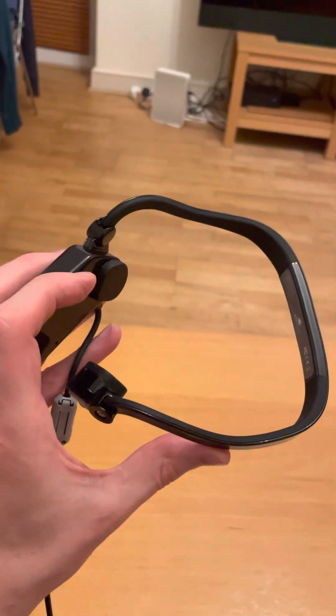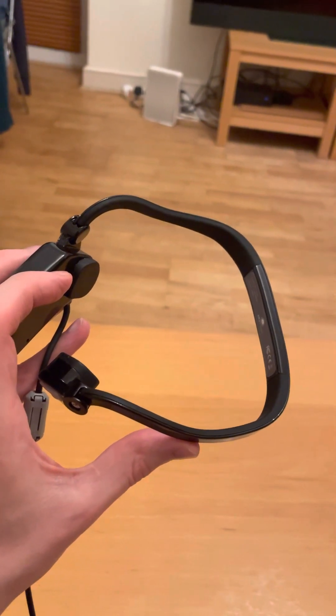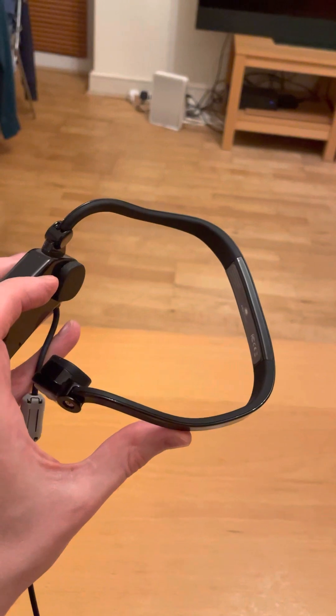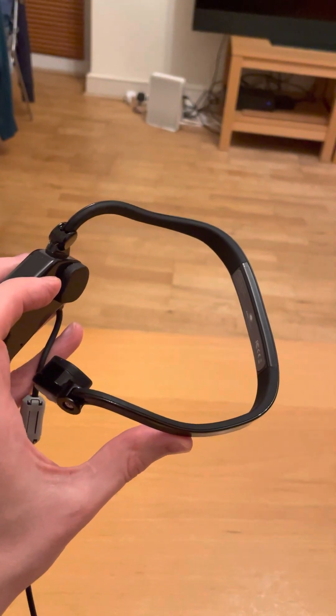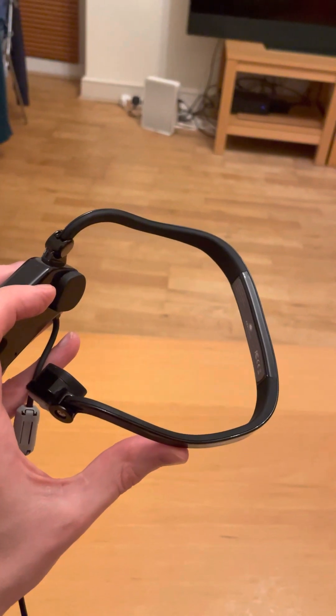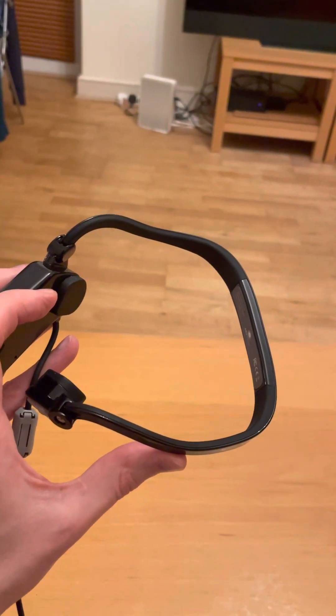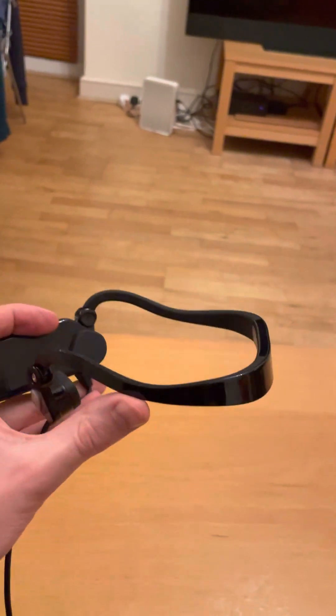It goes around the back of your head. You almost wear it like the opposite way to how you'd wear a pair of glasses. The band goes around the back of your head, and then the bone conduction earphones sit over your ears and the speaker pads sit on your cheekbones. That's how you wear them.